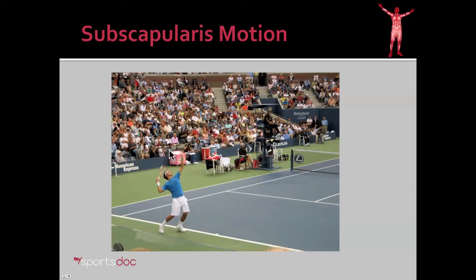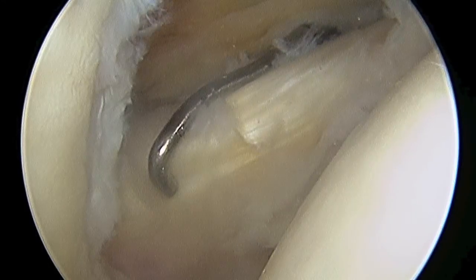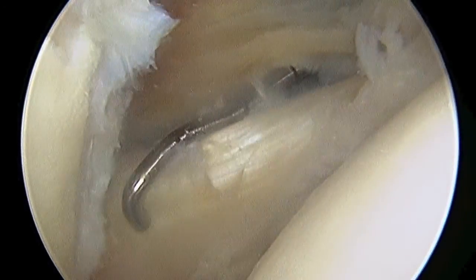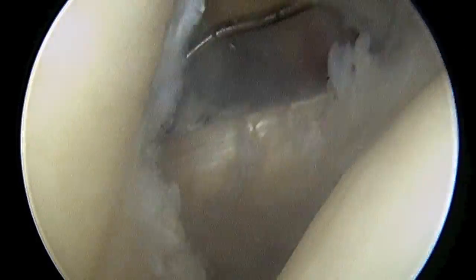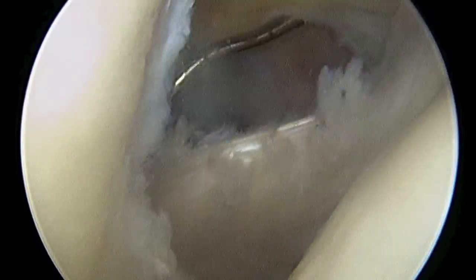The subscapularis motion is very important in athletics for any type of throwing or overhead serve. Here we have an arthroscopy video of a normal subscapularis. I'm looking from the back of the shoulder, and you can see the tendon as I internally and externally rotate the shoulder and how it moves.